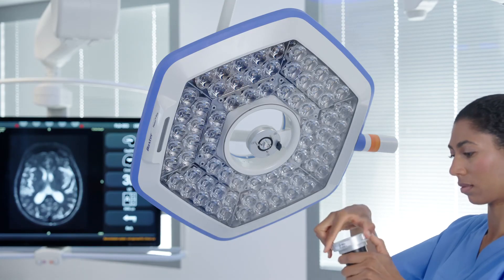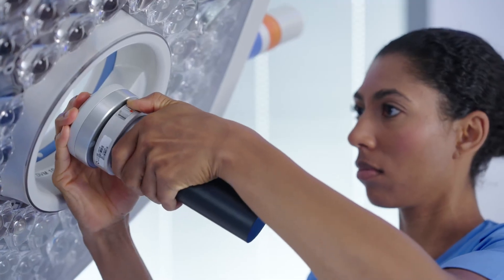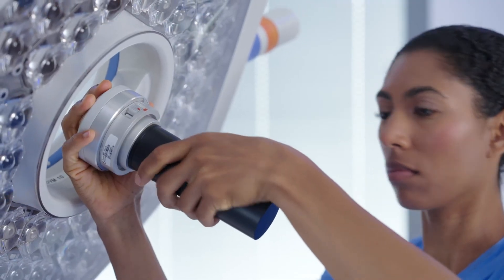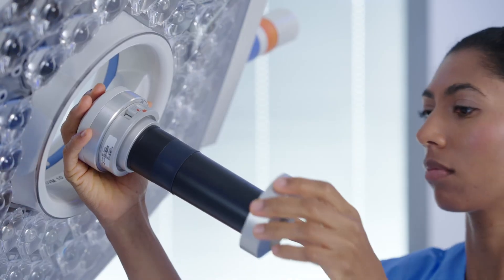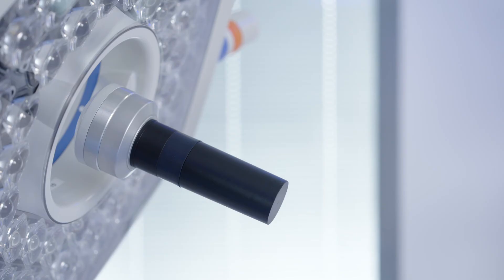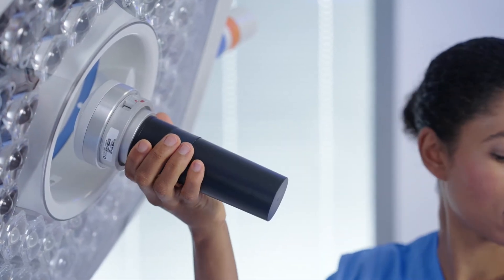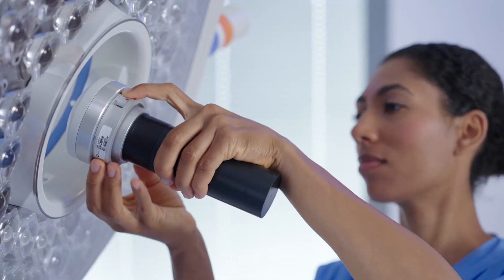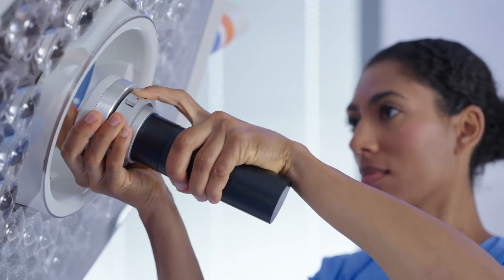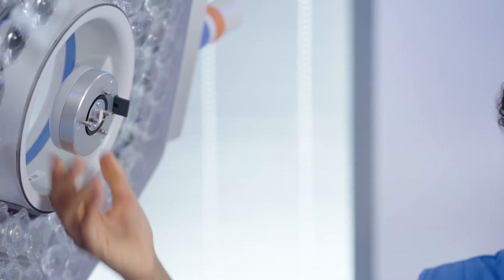To attach a handle, match the prongs on the handle to the light head, slide back the red release button, and plug the handle in place. Slide up the trim ring and rotate until the locking button engages. To remove a handle, press the locking button on the trim ring to release, rotate, and slide off. Slide the red release button on the handle and pull down. Please note, the trim ring is not required for the camera handle.